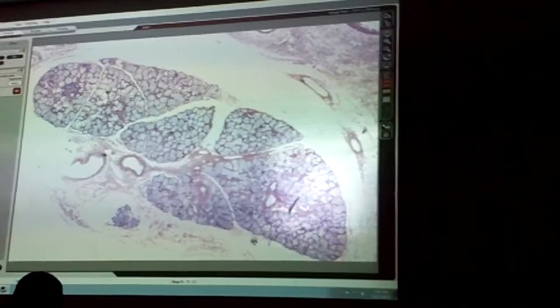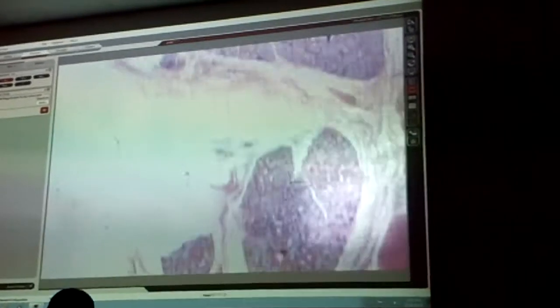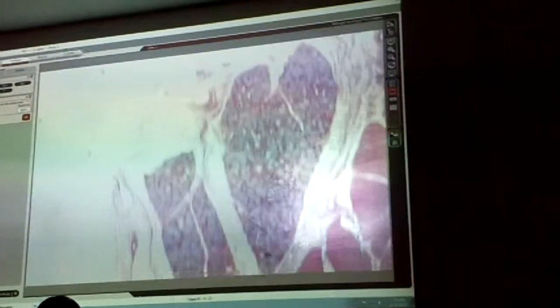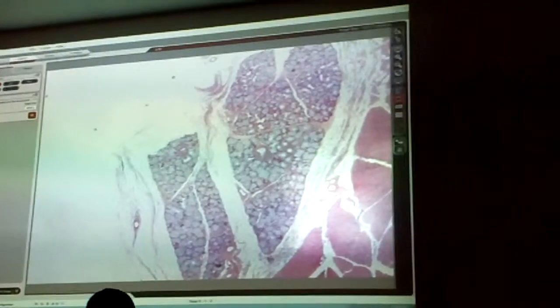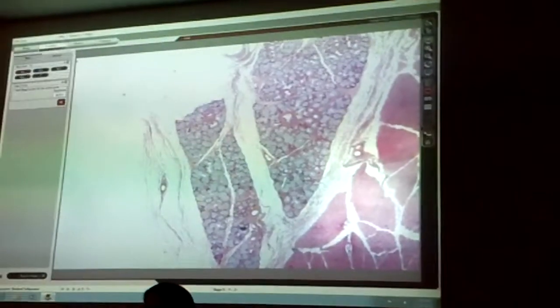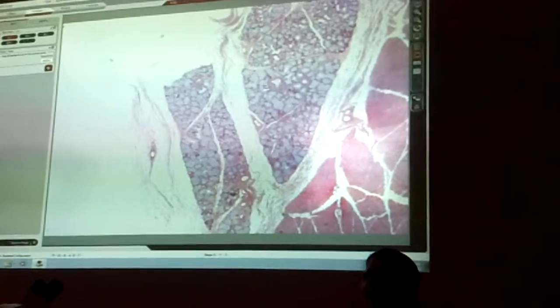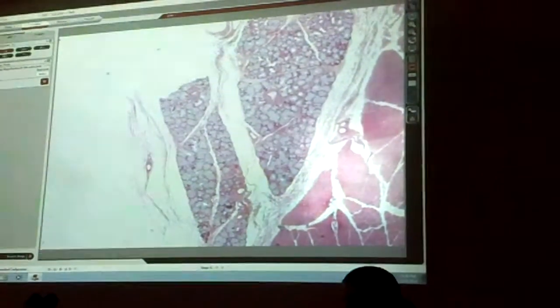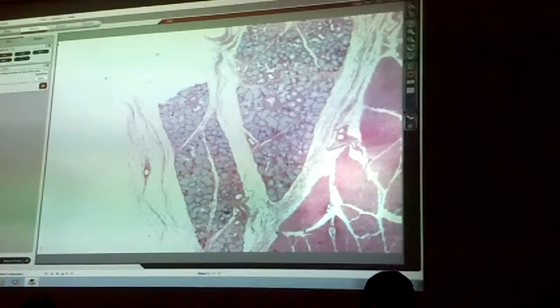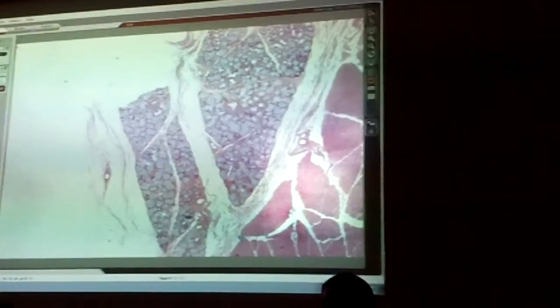So this is something that you would look for to distinguish that this is the sublingual gland. And if you think about mucus and that kind of secretion, then you can think of your tongue involved. Making really wide connections here, but if you think of lingual, tongue, more mucus, mucus acini.